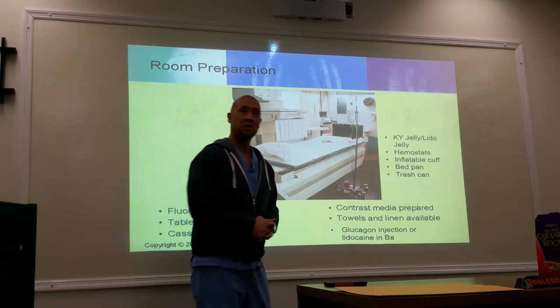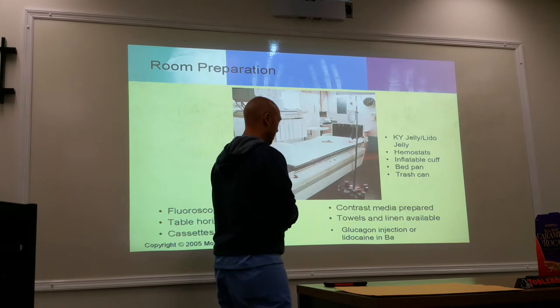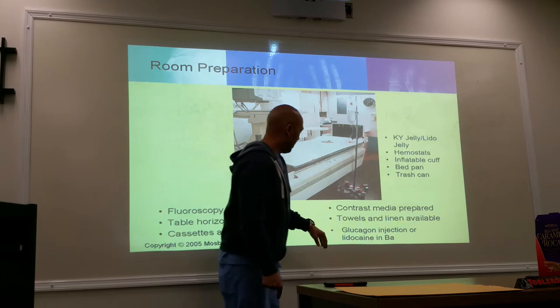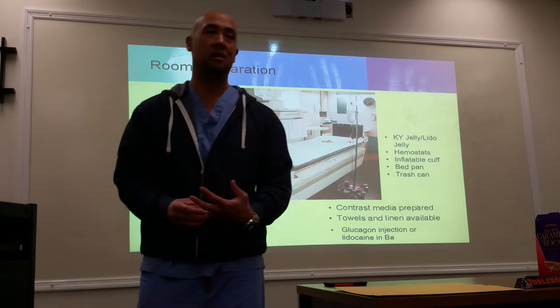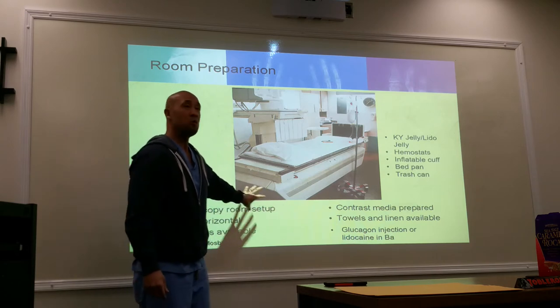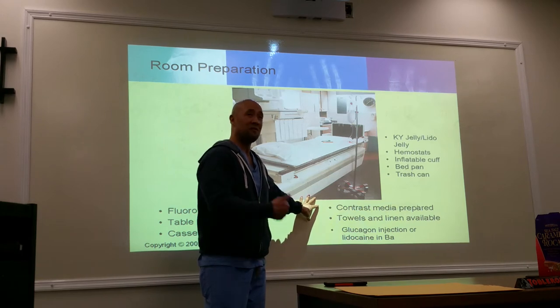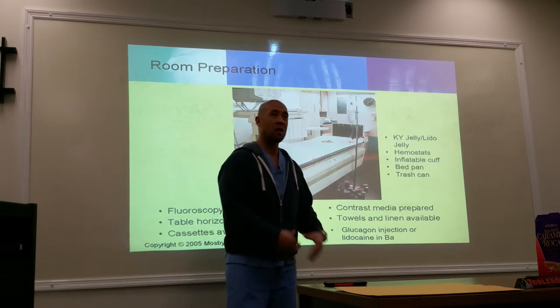Hemostats, you guys know what hemostats are? They're just basically forceps, they're clamps, so I have a lot of those handy. Inflatable cuff for the enema tip, and then some glucagon. Make sure that's readily available. What's the whole purpose of glucagon? Diabetics. Okay, not so much diabetics, but yes, for diabetics, but this is good for someone who may have bowel spasms. When you're putting that contrast, when you're putting stuff in there, they may have very, very mean bowel contractions. So the glucagon will help relax those muscles.